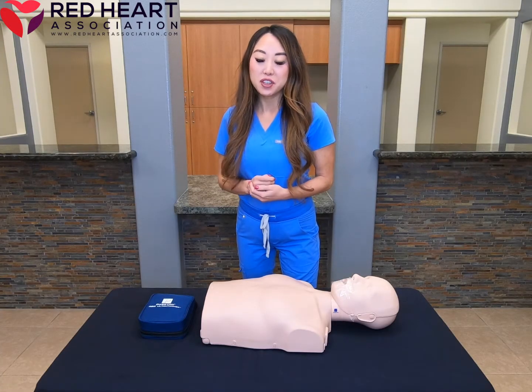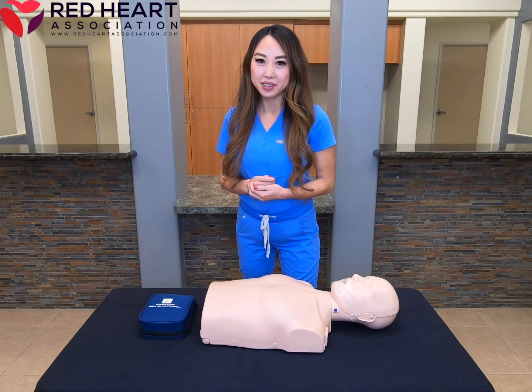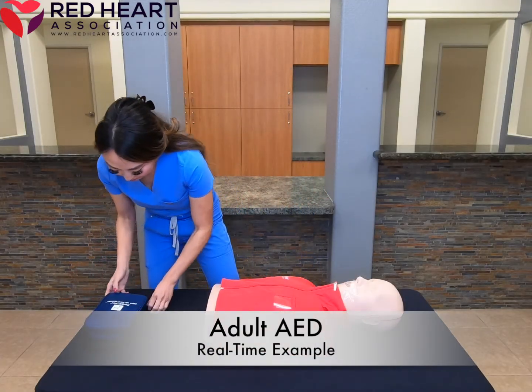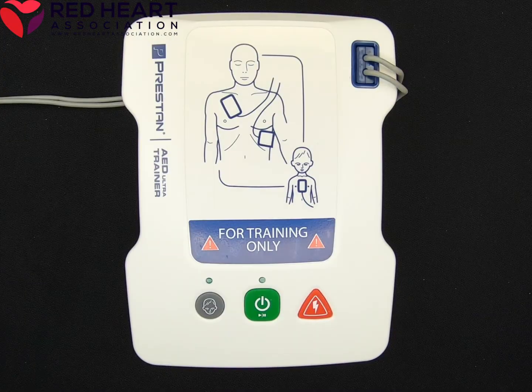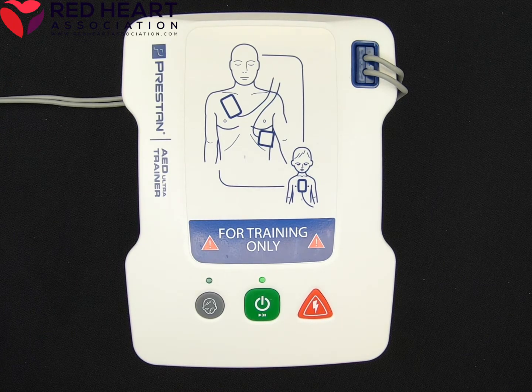Now, let's review all the steps we've just covered using a real-time example. Adult patient. If the patient is a child, press the child button. Remove clothing from the patient's chest.